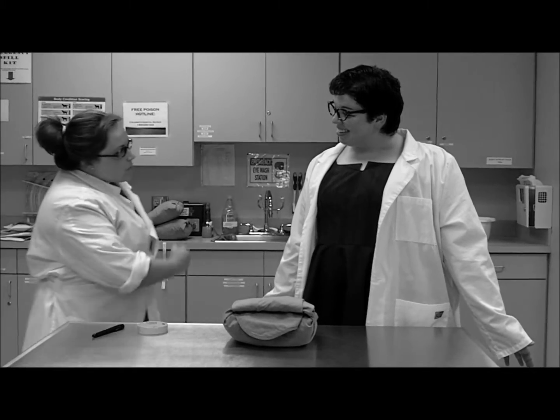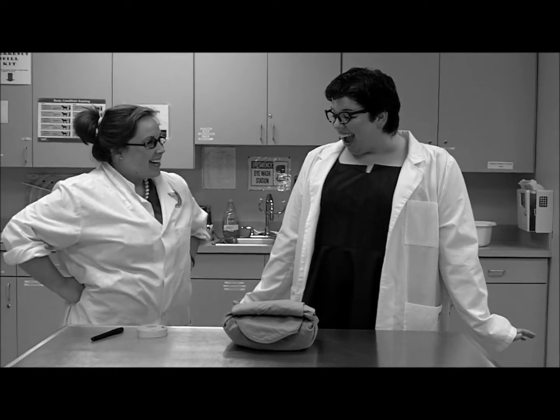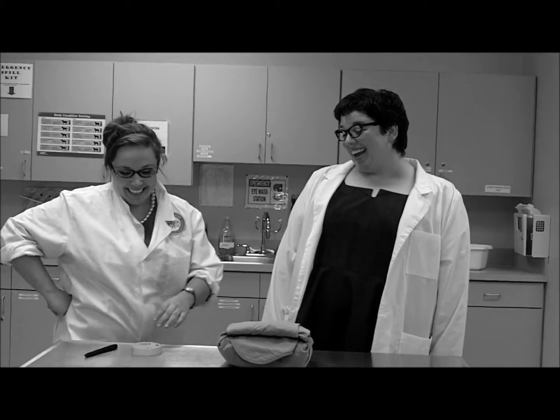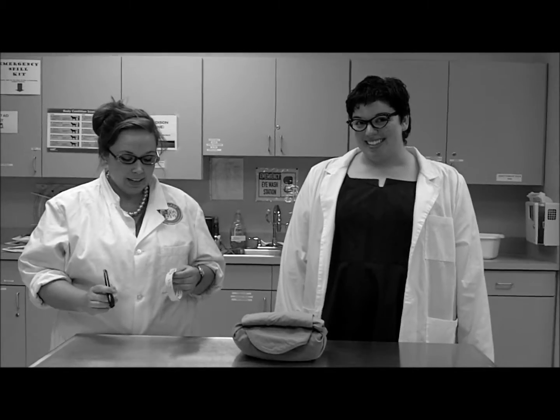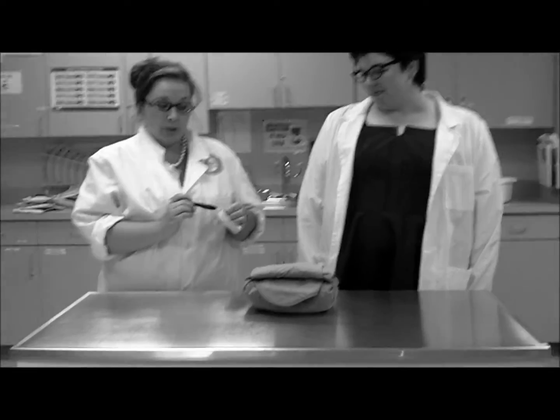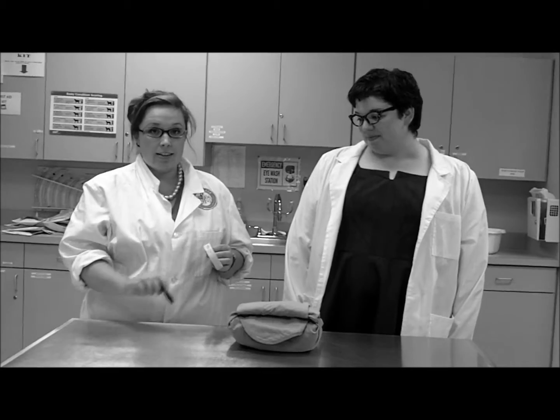That was swell, Emily. What's the last step, Randy? The last step in pack wrapping is to label your pack on a piece of autoclave tape with your initials, the date, and the contents of the pack.